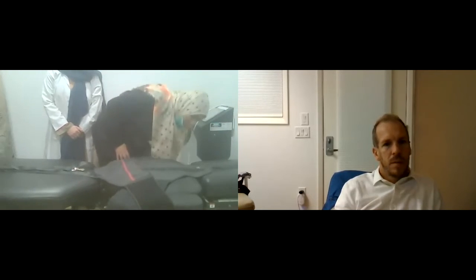One thing I want you to check is whether your computer is on right now. I mean the computer on the table, right next to where the white cord is.